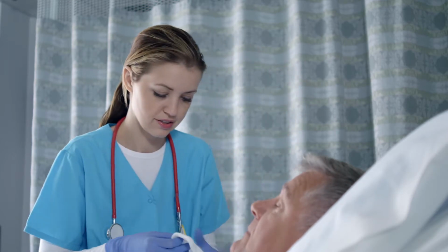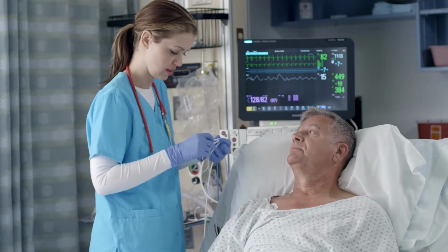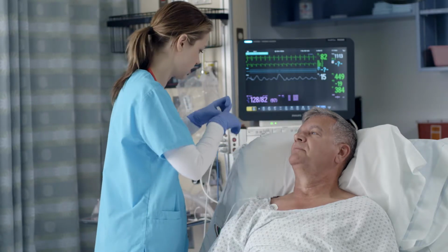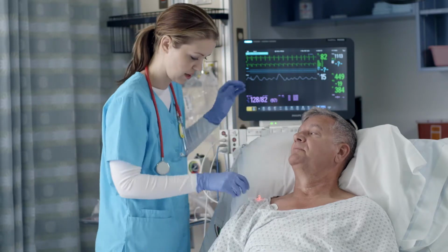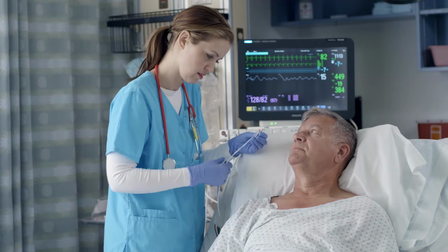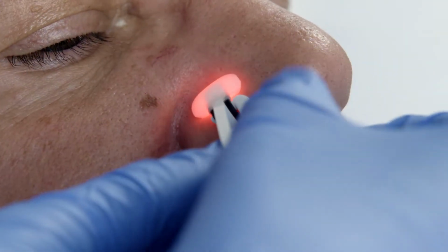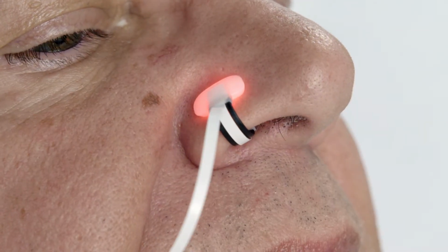Application begins with good site prep to ensure a clean connection and a strong signal. Wiping the outside of the ala, and if necessary, swabbing the inside of the nose to ensure clean contact is important for optimal performance. Once the site is prepped, use the provided applicator to apply the sensor to the ala on the back part of the nostril toward the cheek. Note that the sensor has been designed specifically to fit on the ala with the larger rectangular curved pad and cable on the outside. Once in place, remove the applicator and position the sensor fully onto the ala.